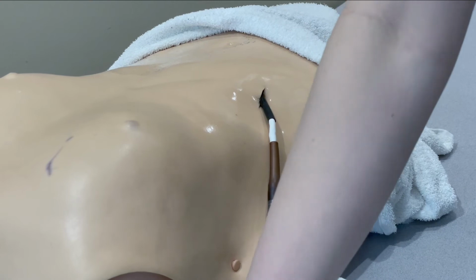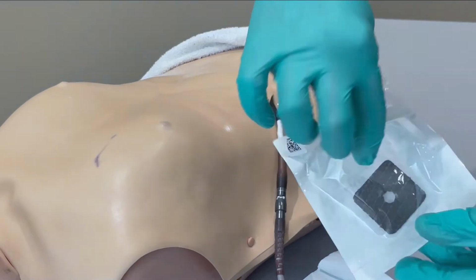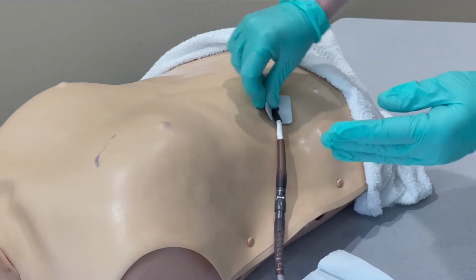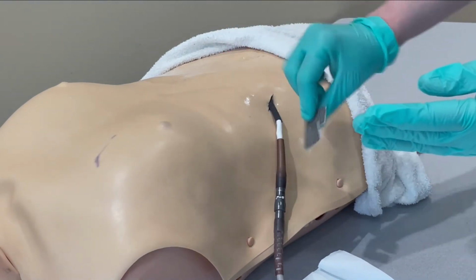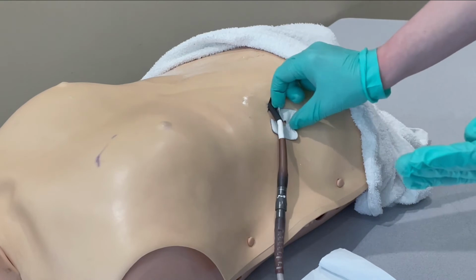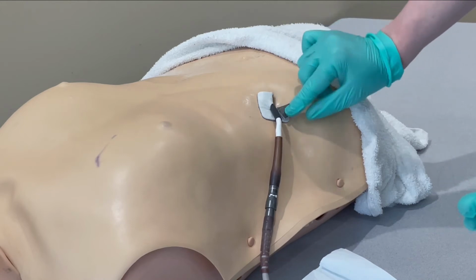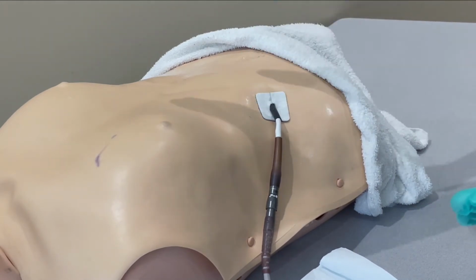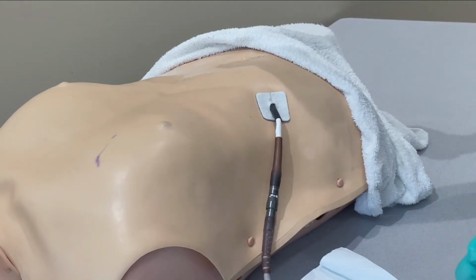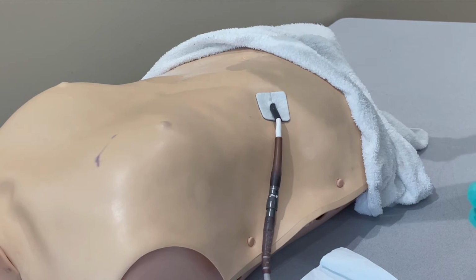We're going to go ahead and open up our silver disc. Now we can use our still sterile hand to take the disc out. And we are going to put this around our driveline side, like so. So silver side is down, a very important part of this process. And it's just going to wrap around the outside of that driveline. It does not matter where this slit lands, as long as the disc is in place and it's not going to move. And notice as we're doing this, the chlorhexidine is drying. You never want to put a bandage over a wet chlorhexidine surface, because that can create a lot of skin irritation. So this is drying.